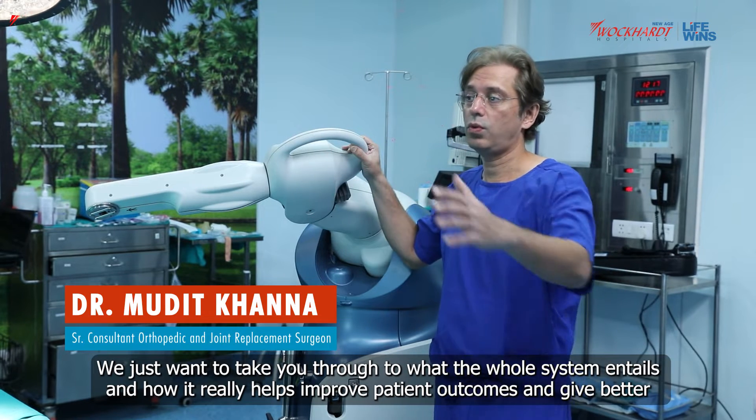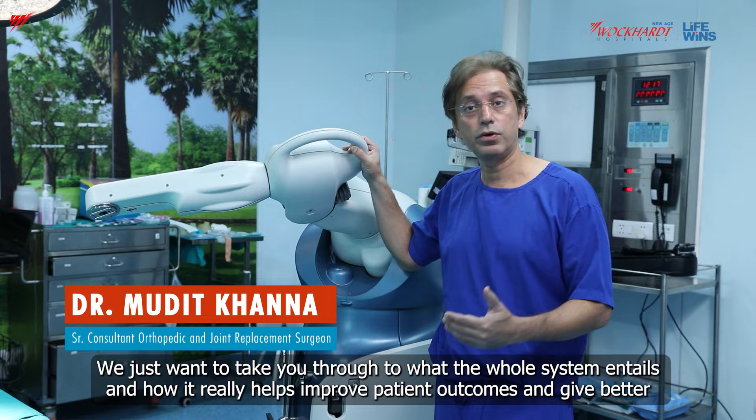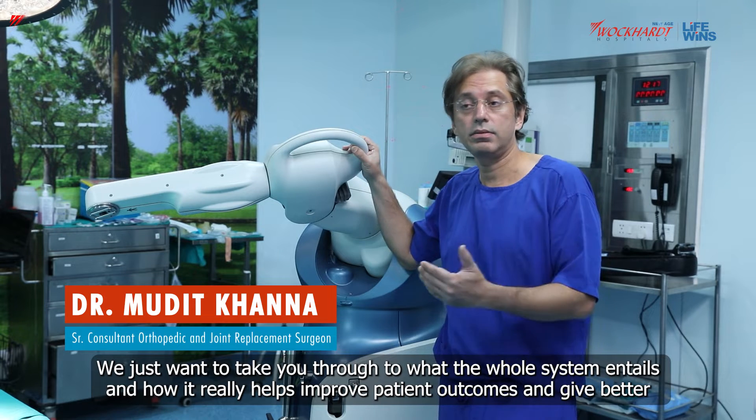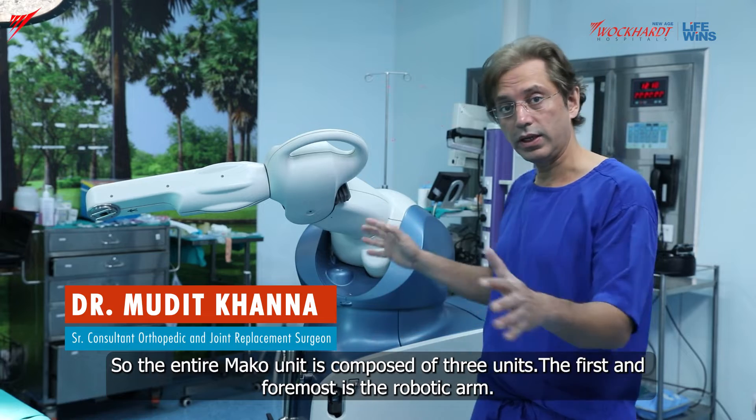We just want to take you through what the whole system entails and how it really helps improve patient outcomes and give better results. The entire Mako unit is composed of three units.